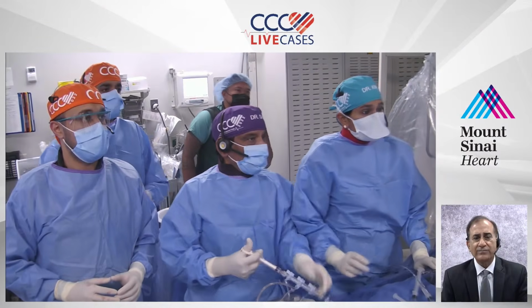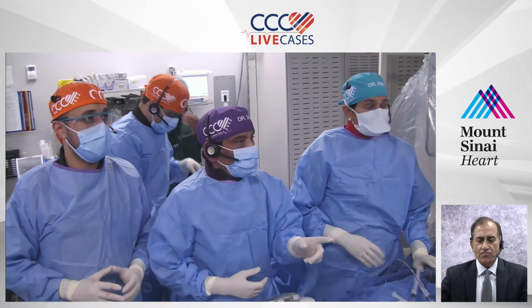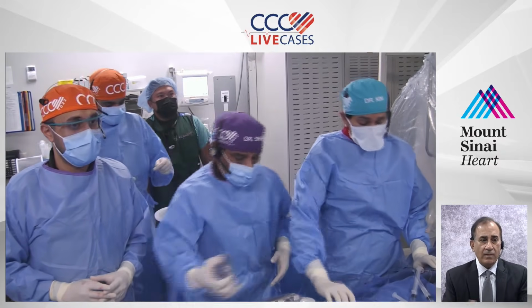Sameer, Anu, good morning. Side hole, yeah. Good morning. Good morning. Side hole. The damping, yeah. Okay.